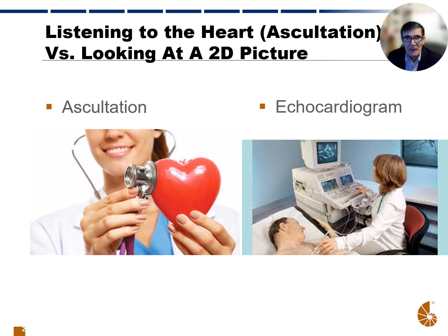Another method of detecting what's going on in the heart, which actually gives you a visual picture, is an echocardiogram, which uses echoes and allows the technician to record pictures that can be read by an expert to determine what's going on inside the heart and how the blood is flowing through the heart. So that's an echocardiogram, or sometimes just called an echo.